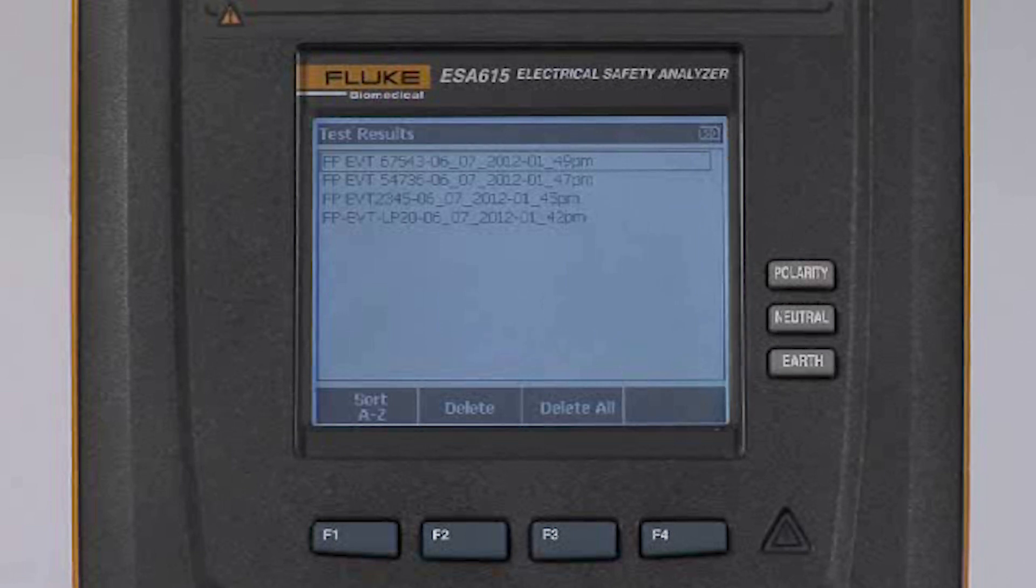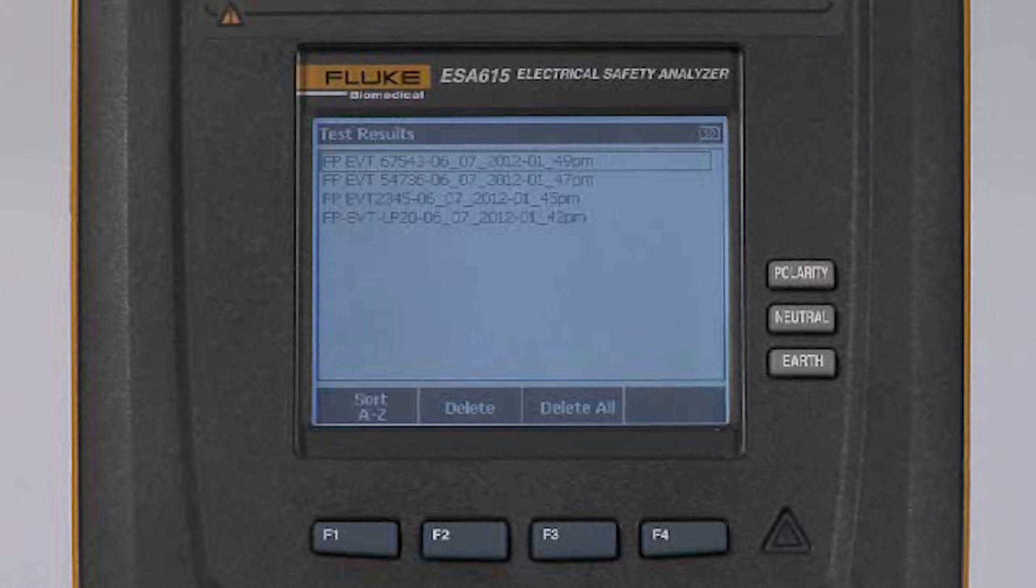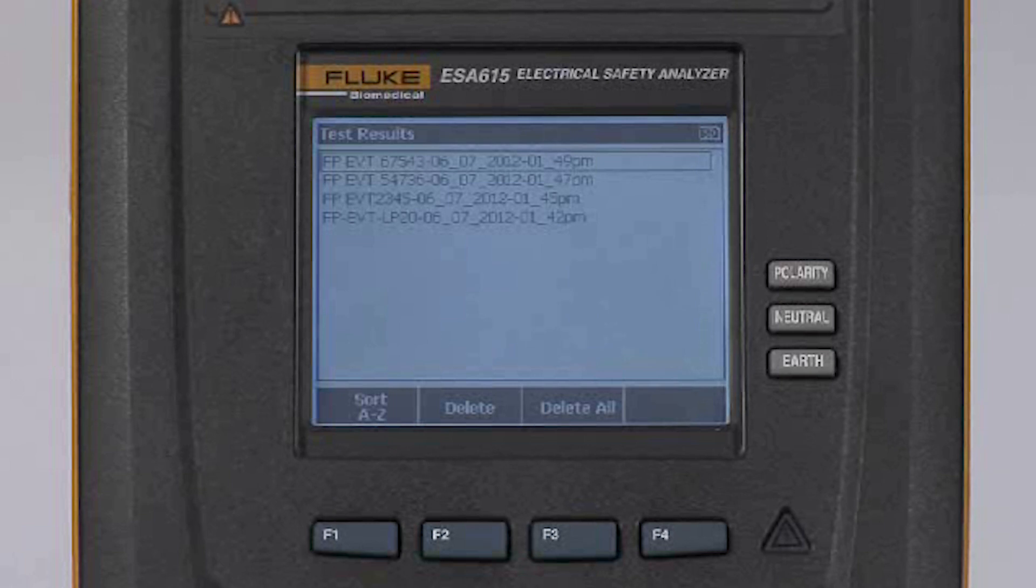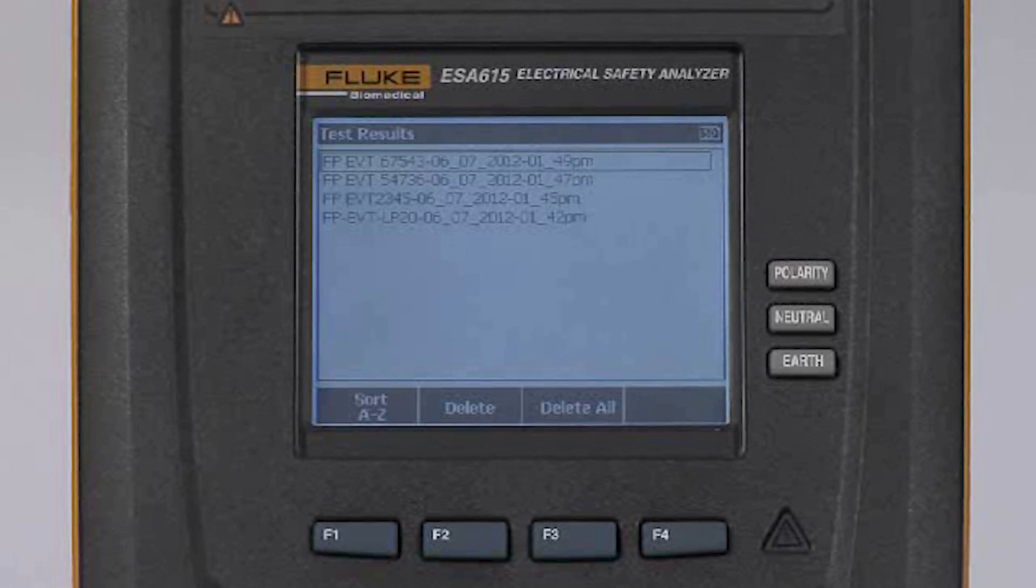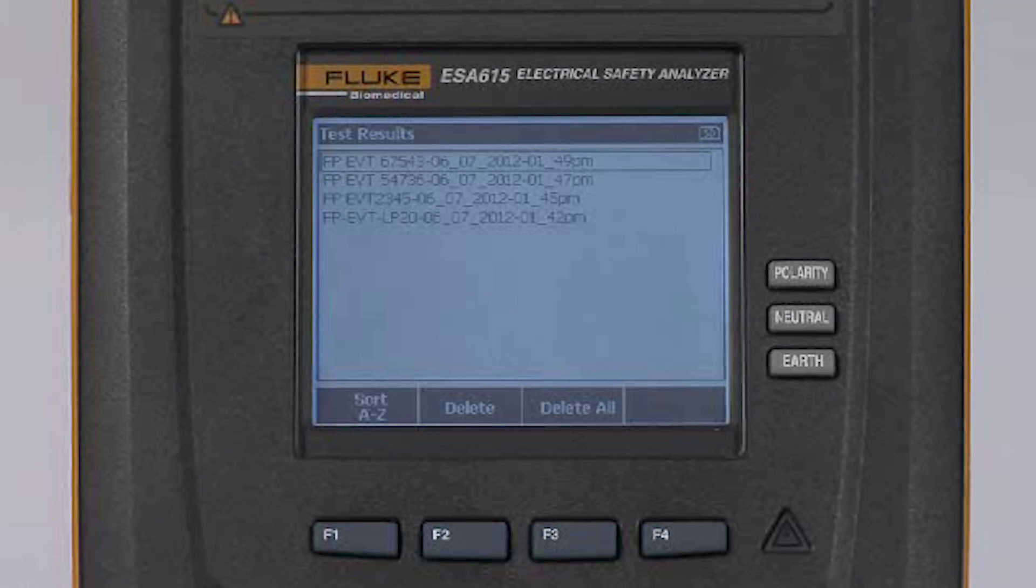F3 allows me to delete all, and that assumes that I have archived those test results to some other device like my computer or where I have printed out my test results.